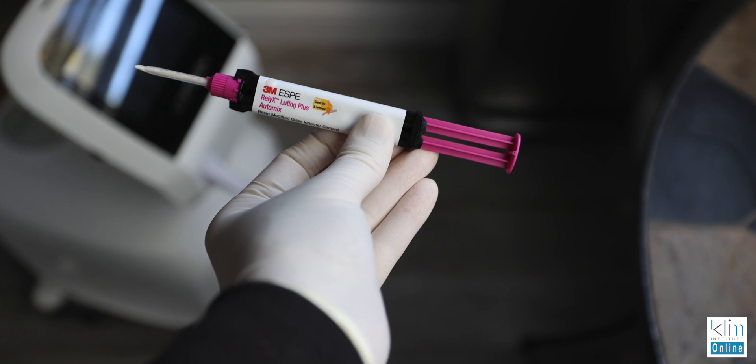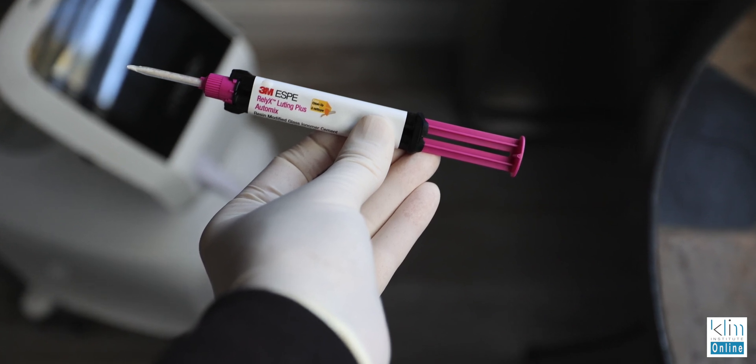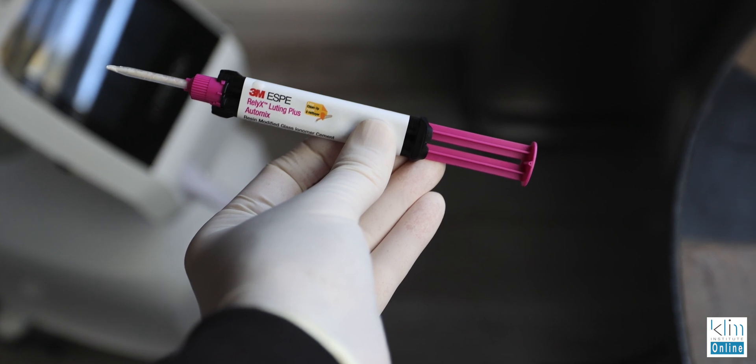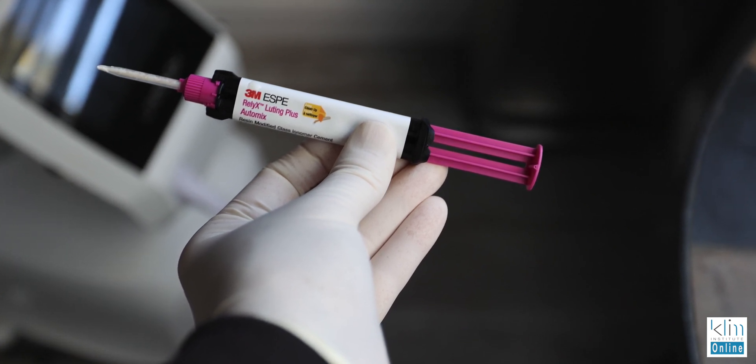Then we cement it in using a resin glass ionomer — I like the 3M where we can activate a light cure on the margin and it solidifies that cement, so we don't get any moisture contamination as the final polymerization of that cement happens. It's also auto-cured, so it's both light-cured and auto-cured — that's the 3M resin glass ionomer.